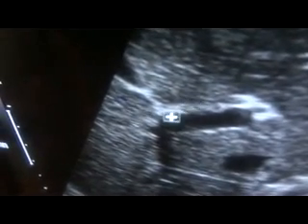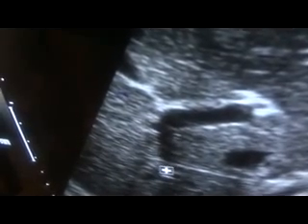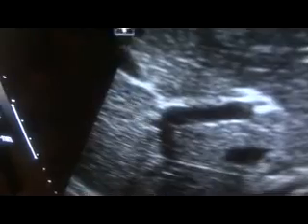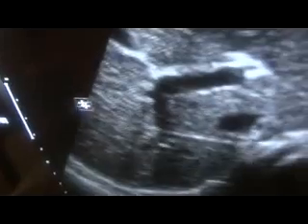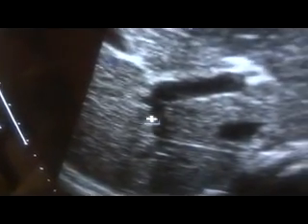The waves are being transferred to the transducer when you are scanning perpendicular to a particular organ or vessel, and in this case the beam is striking parallel to this area and passing straight, not returning back, and you don't see any periportal echoes. So this is an exception which you may come across that may confuse you, whether this is a hepatic vein or a portal vein. This is a portal vein. Now why is it not giving you periportal echoes? The reason I have informed you.